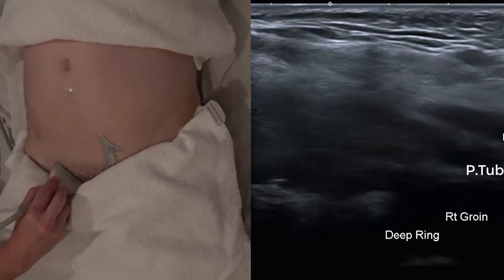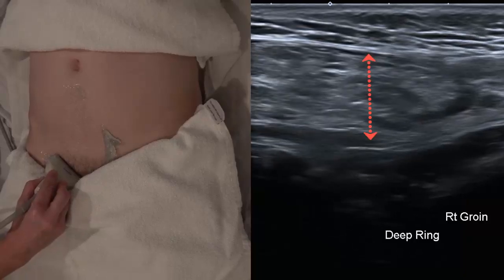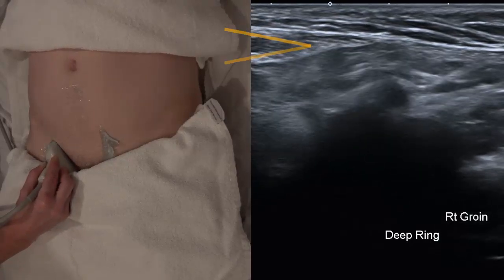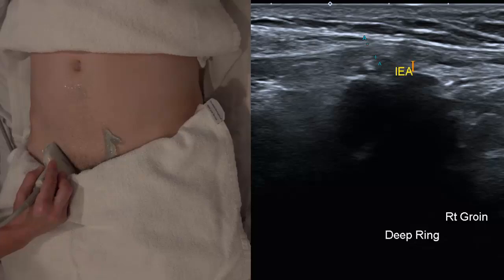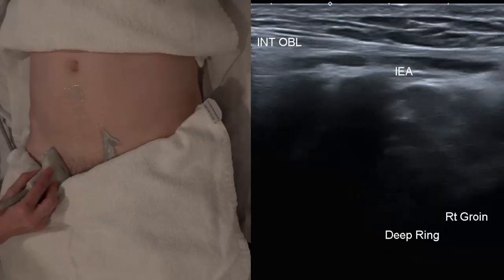You can see it's using the deep ring. It's really helpful to compress and take a little video loop as you push that contents back into the abdomen. We can see clearly something compressed into the abdomen. This is the deep ring now measured with compression, or once the hernia has been reduced. The inferior epigastric artery and your internal oblique forming that little muscular triangle are the two most characteristic anatomic landmarks around the deep ring — the entrance to the inguinal canal.